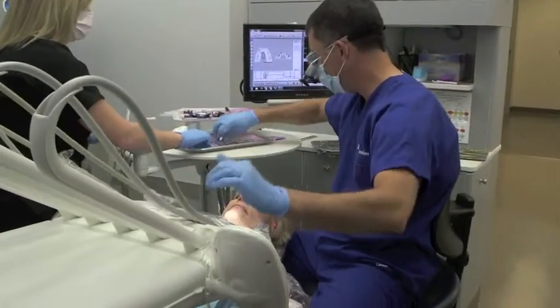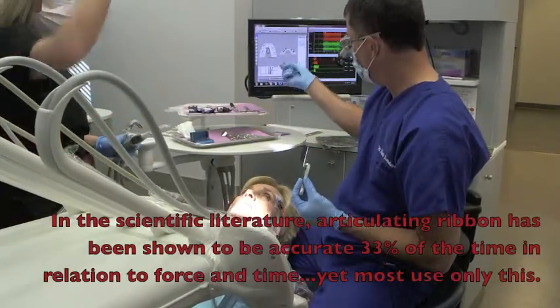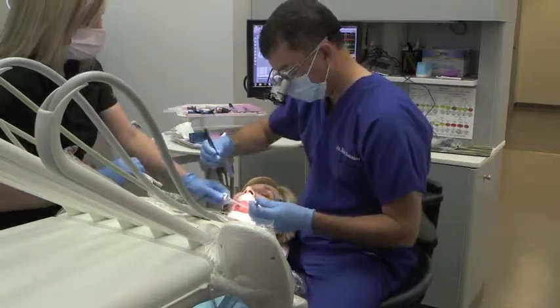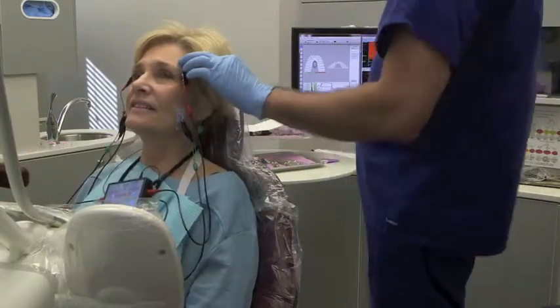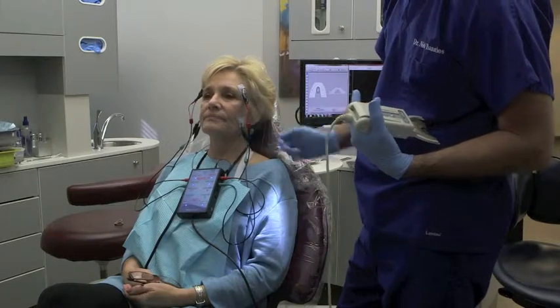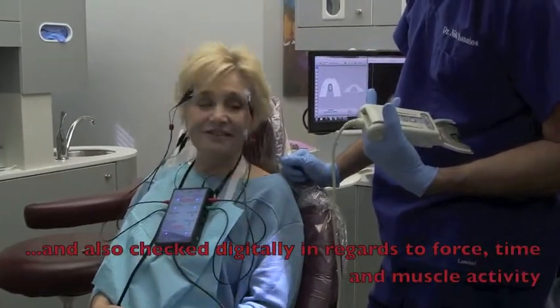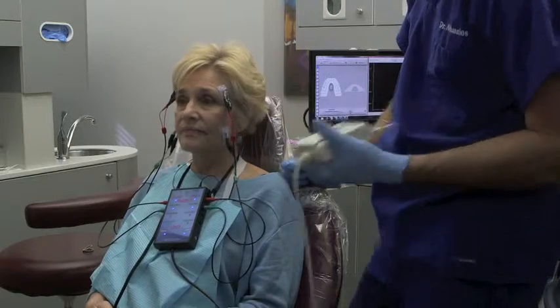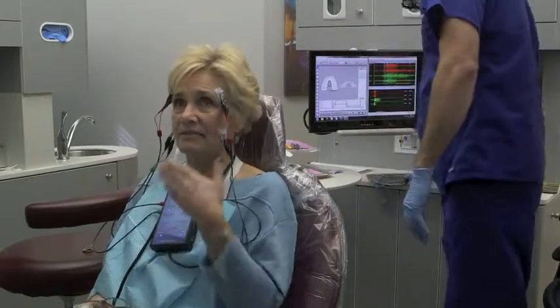Remember, every dentist on the planet, this is all they use — this only shows me where. The left of the screen shows me when and how much. The right side with the muscle shows me what the muscle's doing. Then you have all the information. What did that feel like? That was smooth — usually it felt like I had to force it. And it was even. It feels more relaxed. Is your neck feeling different? Try moving your neck left and right. My neck is actually looser. That's surprising. Everything feels more relaxed, that's all I can say. A lot easier — it gets easier and easier every time.